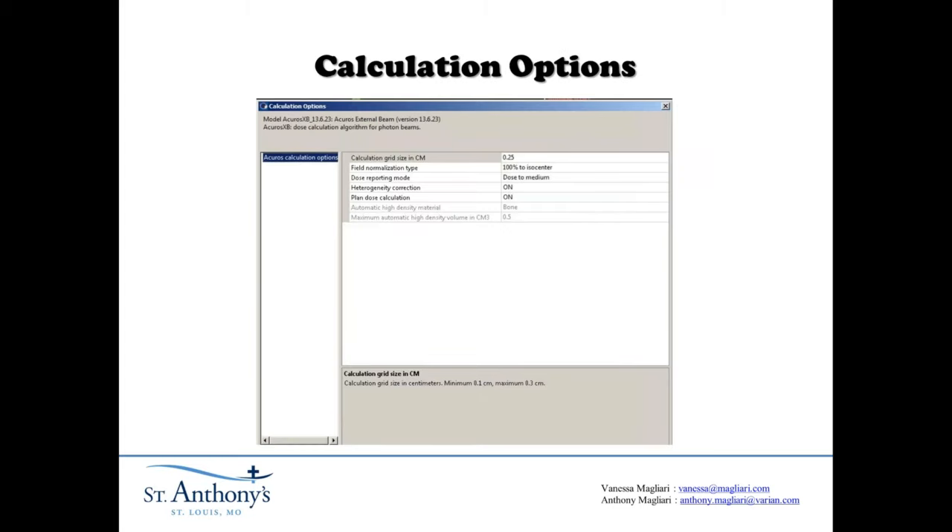For the calculation options, we used a calculation grid resolution of 0.25. In Acuros, you can choose whether you want dose to medium or dose to water — definitely use dose to medium for best results.